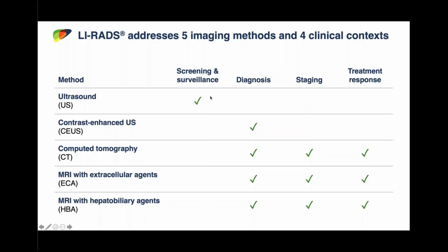So we can see that currently LI-RADS applies ultrasound for screening and surveillance. These other methods are all used for diagnosis, and CT and MRI are also used for staging and for assessing treatment response. We're developing a protocol or an algorithm to use contrast-enhanced ultrasound for assessing treatment response, but that is not yet available.